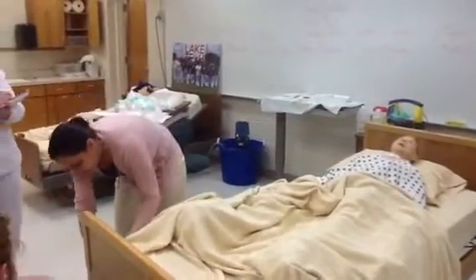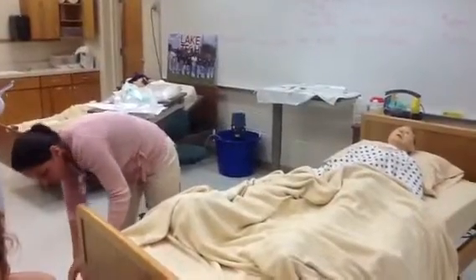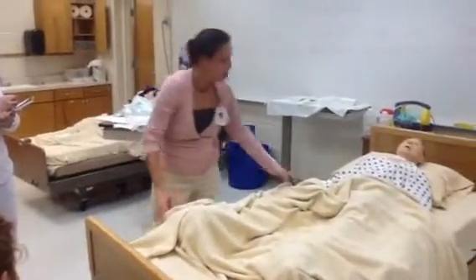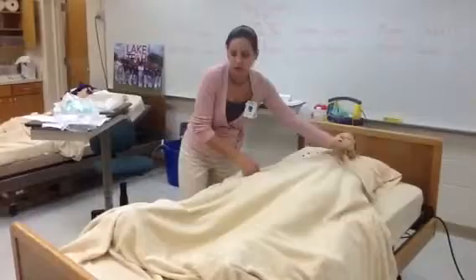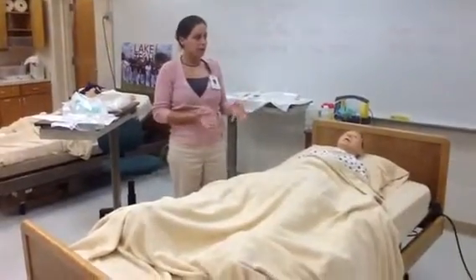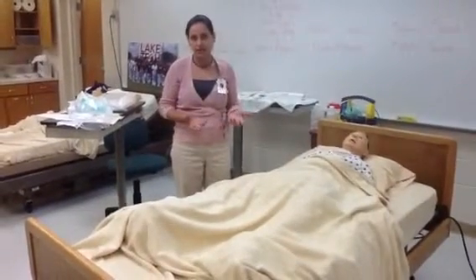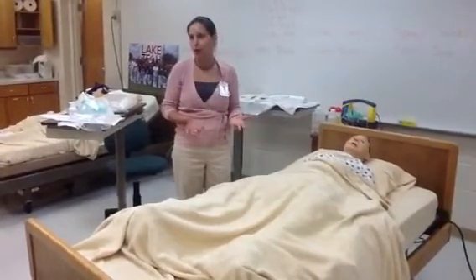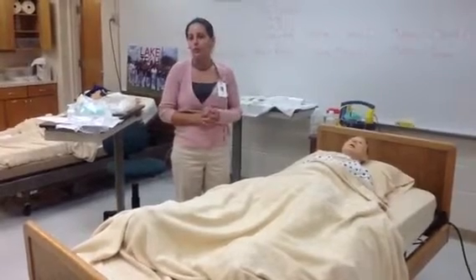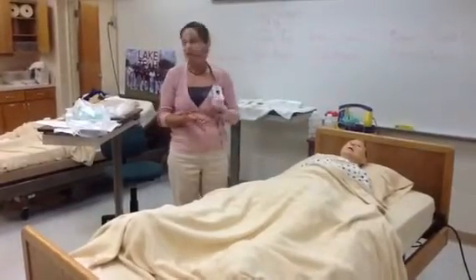And I'd like to get it into a spot that is actually a visible part, so that I can monitor it frequently without bothering my patient. You can provide peri-care after the placement of the catheter because the iodine swabs, if the iodine is left on the mucous membrane, it can cause a chemical burn. So you will want to freshen your patient up, and then you're going to note the date, the time, how they tolerate it, the size.